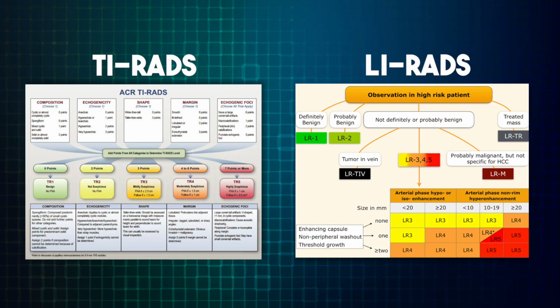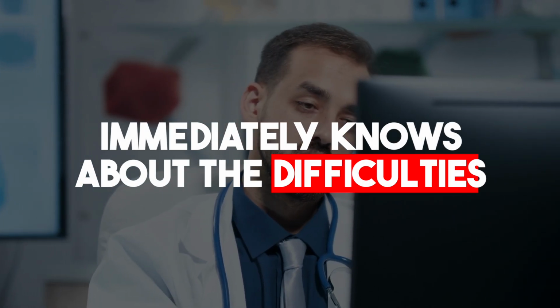One particular use of structured content is to assist in the implementation of clinical decision support systems such as TIRADS or LIRADS. These systems use very specific terms, definitions, and grading points. However, everyone who's tried to implement something like this within one of those tools immediately knows about the difficulties. Similar to level 1, efficiency and rigidity can be challenges, especially for experienced radiologists doing reporting.